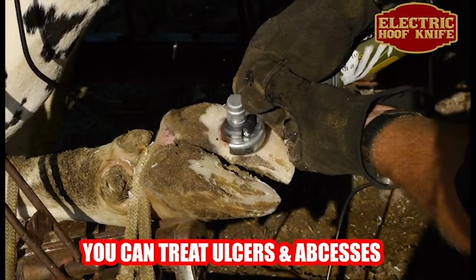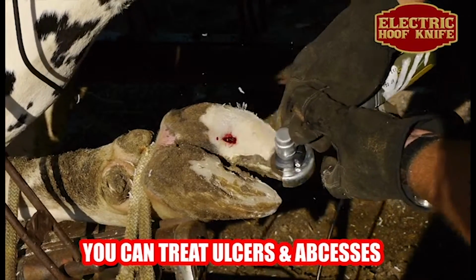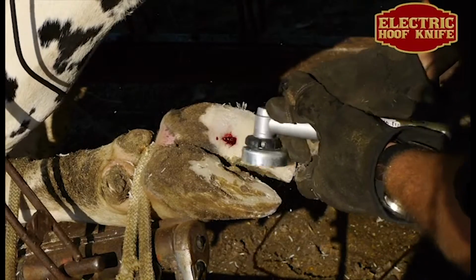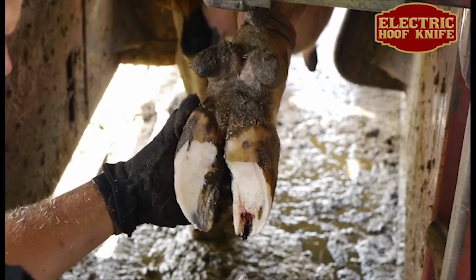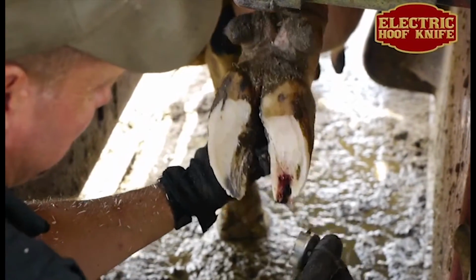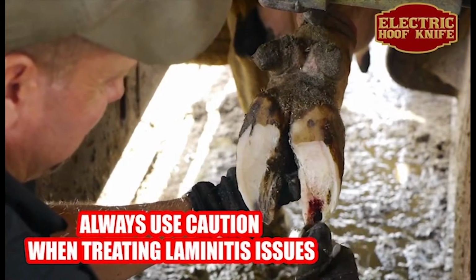The electric hoof knife can be used to fix ulcers and abscesses. The best way to learn how to use the electric hoof knife for fixing laminitis problems is to just practice different techniques as you encounter different problems. It will not take long before you are comfortable using the electric hoof knife to perform all kinds of hoof care tasks. Always use caution when fixing laminitis and hoof disease problems.